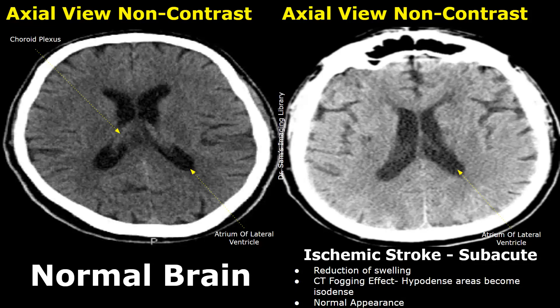In a subacute ischemic stroke, the time from onset is between one to three weeks. Stroke is difficult to diagnose during this period because the appearance on a CT scan may appear normal. The swelling subsides — we will not see any swelling during this period. And the hypodense areas start to become isodense, which leads to a normal appearance. In simple words, the density of the tissue at the affected site increases because of the repairing mechanism of the brain tissue, which works on reducing the swelling and attempts to repair the brain tissue.